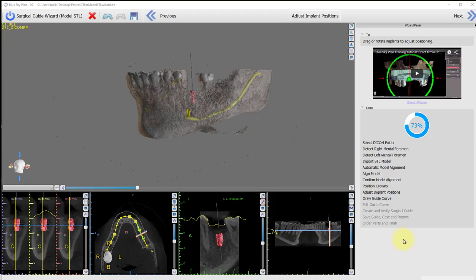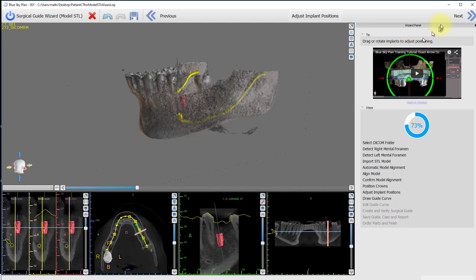BlueSkyPlan now has a guide tube collision detector that senses when the guide tube position will interfere with the proper seating of the surgical guide in the patient's mouth. We will see how this works first in the wizard mode and then in the normal or advanced mode. To save time in this demo, I've already placed the implant deliberately where the guide tube will collide with the anatomy on the model, in this case the soft tissue and the neighboring crown.